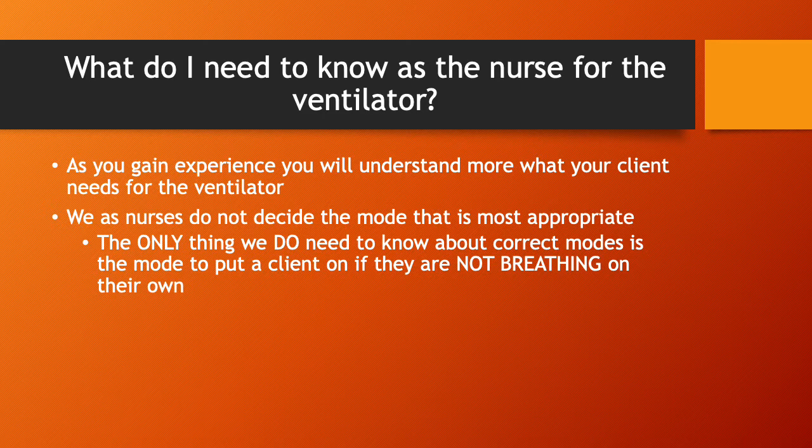Just recognize, at this level, you don't necessarily have to know, okay, the COPD patient needs this kind of mode, or they need more volume or more pressure or less volume, less pressure, all that stuff. That's not what you need to understand. We as nurses don't decide what mode to put the patient on. It's all doctor preference. The only thing we do need to know is what mode to put a patient on if they're not breathing.